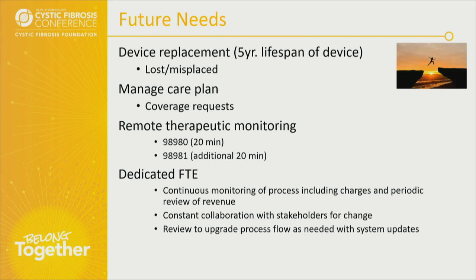And we say to Dabney, it's great. The PFTs are trending up. Stay on the oral antibiotics. Repeat the test at the end of the 10-day course. Continue the increased airway clearance, right? Continue to monitor your blood sugars if they were diabetic. So all those things, if additional time on top of the original time for therapeutic monitoring is provided, you can drop another bill for that additional patient instruction of therapeutic monitoring. Then you can also bill that. So lots of opportunities here.